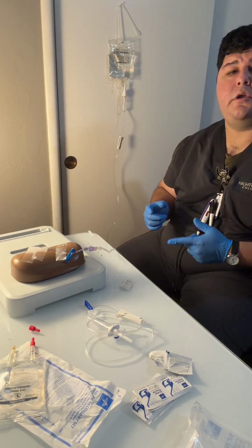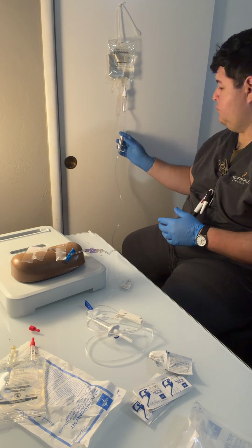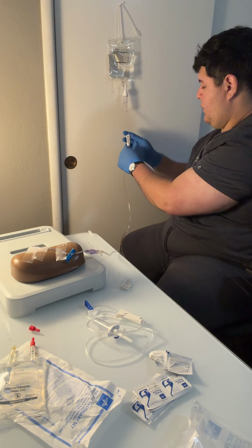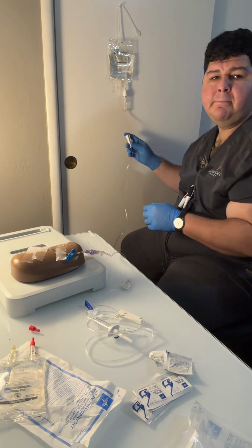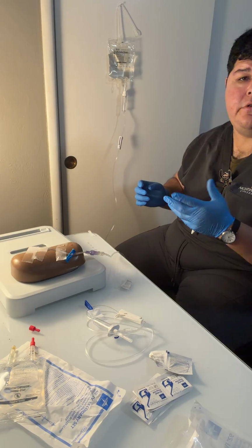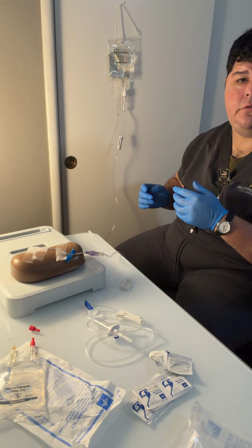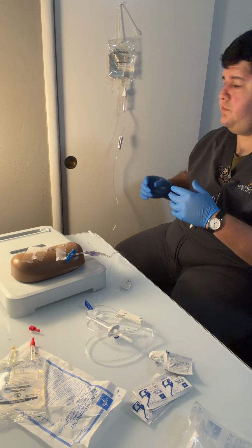Then we're going to slowly open the roller clamp and we're going to count our drip rate. Our primary infusion, we need 38 drops over the minute. So we will time it and adjust the drip rate or the flow at this time.